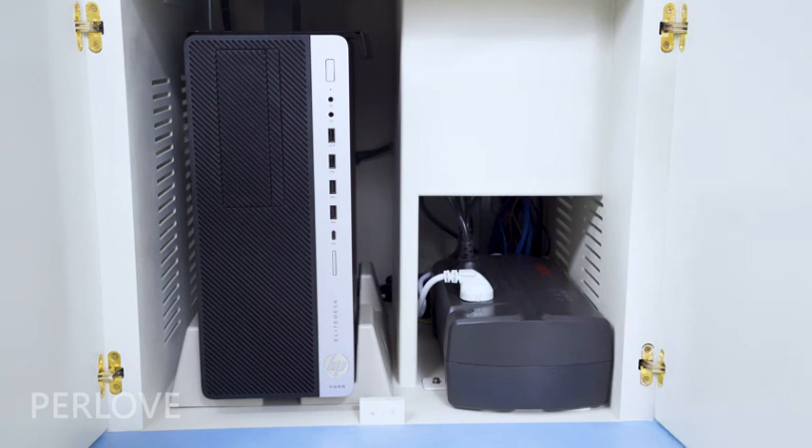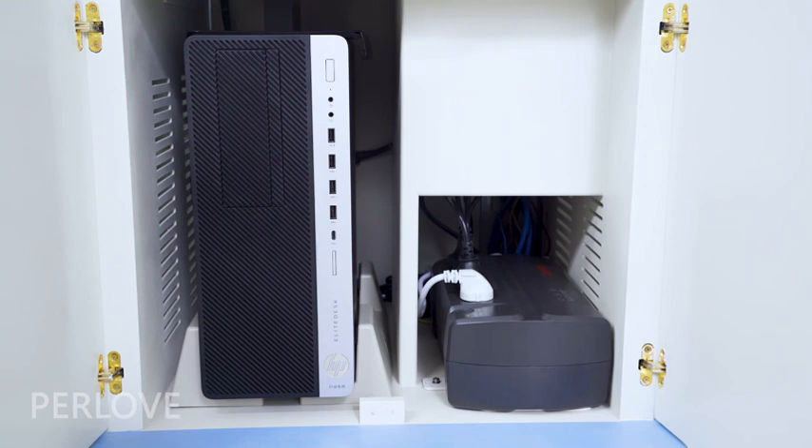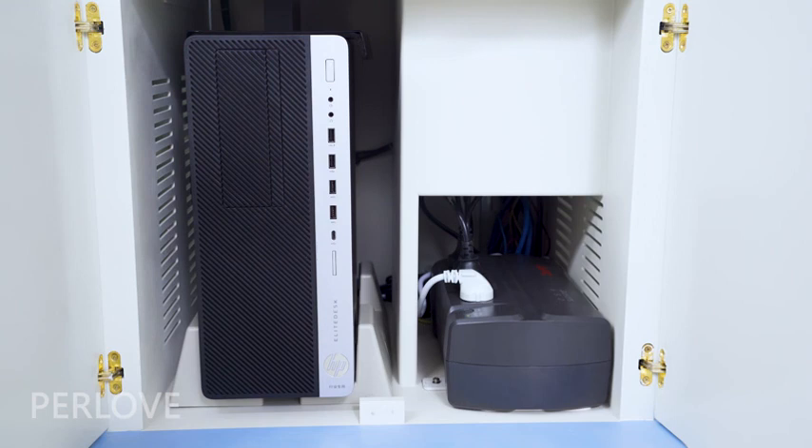The workstation is equipped with a UPS power supply that ensures the computer can last for 10 minutes after a power failure.